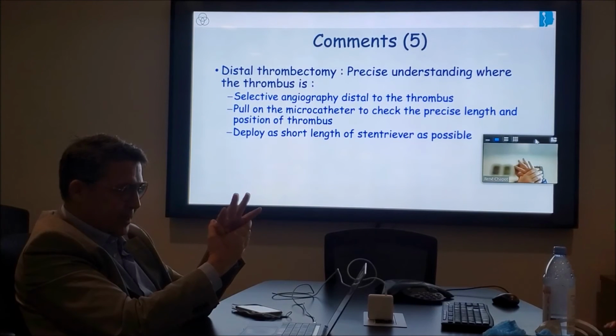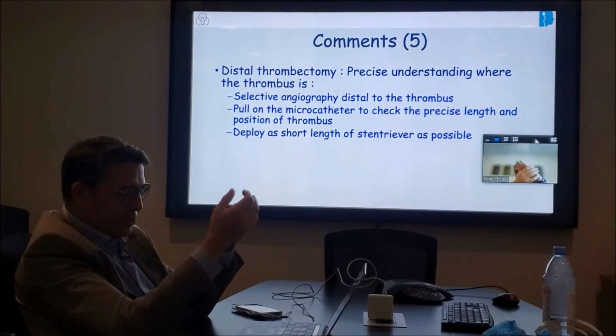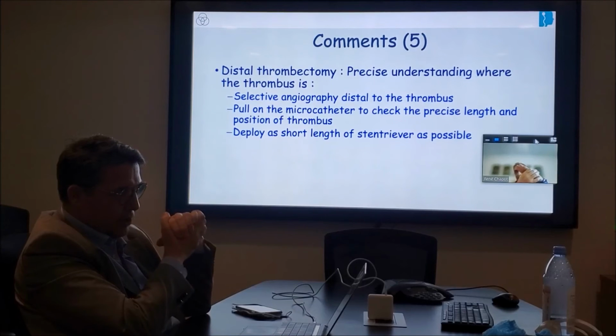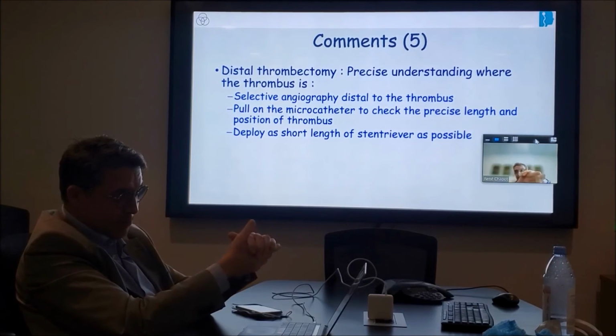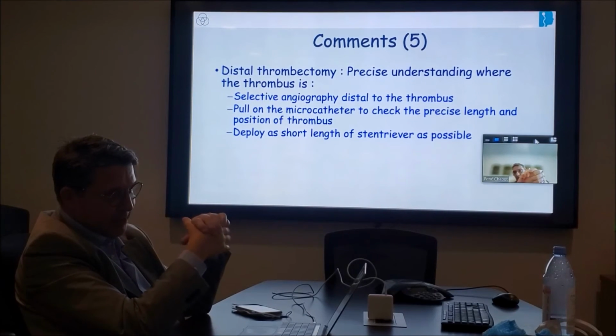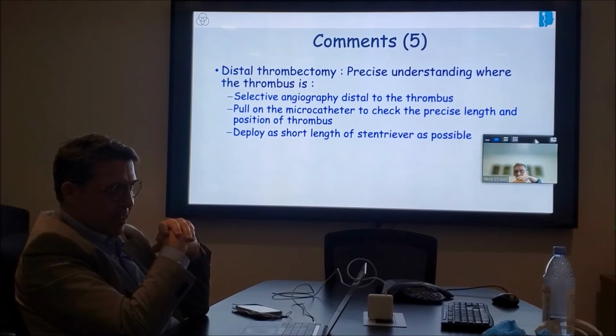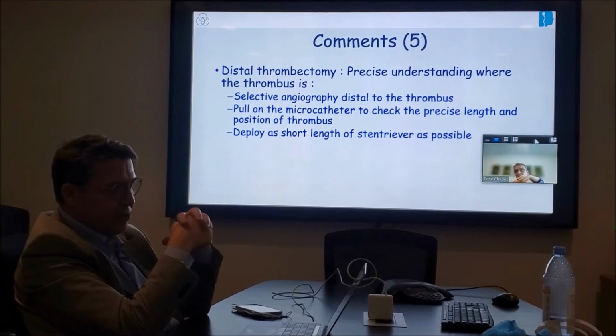By closing the stentriever, at least partially, you can grab the clot; if you completely resheath on the clot, you lose it. But if you close it partially, the ability to grab the clot is much higher, which is the principle of using a stentriever dedicated for white clots that we've been using for 1.5 years, called the Nimbus, developed by Johnson. And it only works if you pinch systematically.